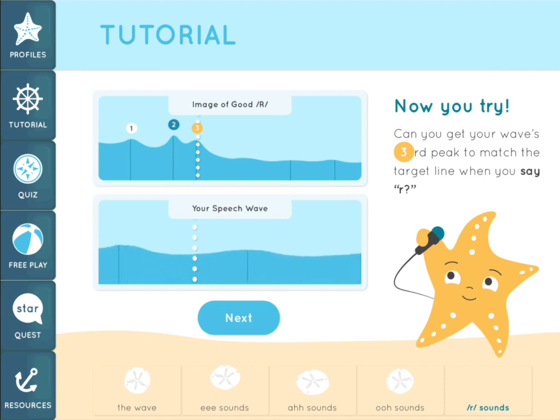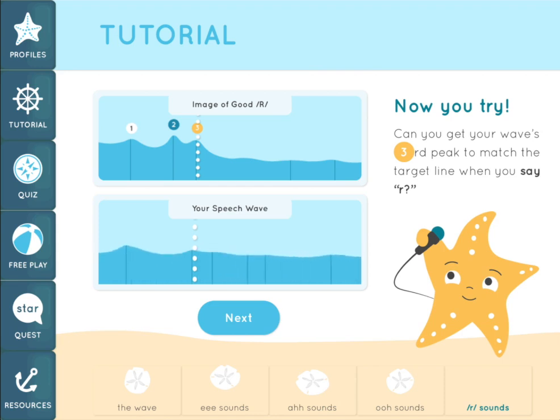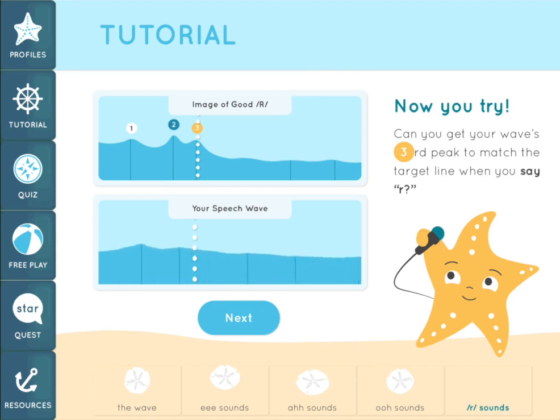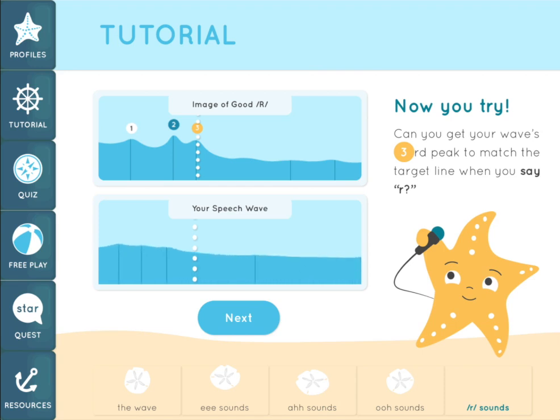Now I'm going to say a not-so-good R sound, and then transition into a really good R sound. Watch how the third peak starts out pretty far to the right during the incorrect R. Then, as the third peak moves to the left and gets very close to the second peak and the white line, the R begins to sound more correct.